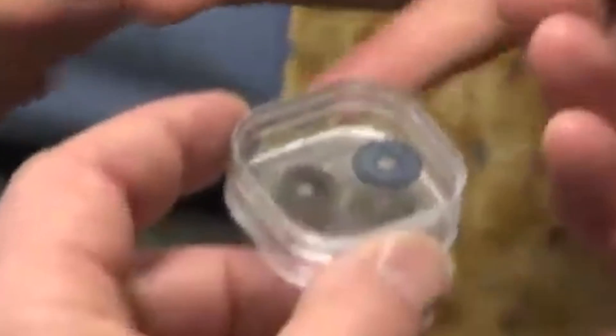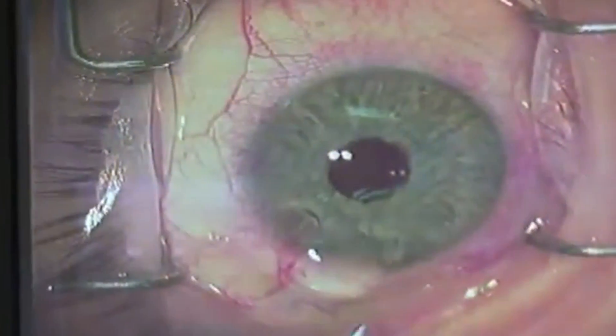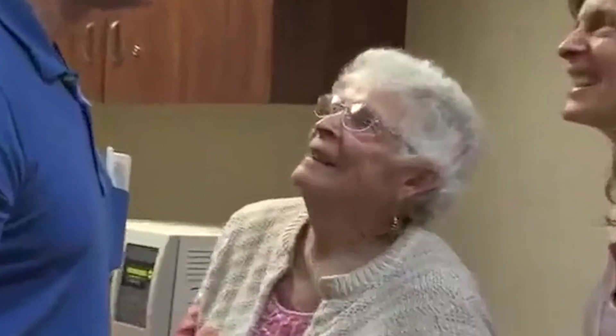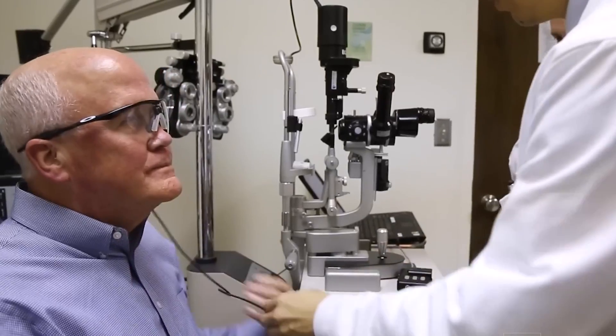Advancements in computer, electronics, and biomedical engineering technology have resulted in the invention of bionic eyes. Bionic eyes, also known as retinal prostheses or artificial retinas, are advanced medical devices designed to restore vision in individuals with severe visual impairments such as retinitis pigmentosa and age-related macular degeneration. These devices work by bypassing damaged or non-functioning retinal cells and directly stimulating the remaining healthy cells to transmit visual information to the brain.